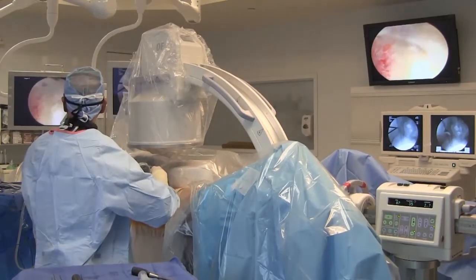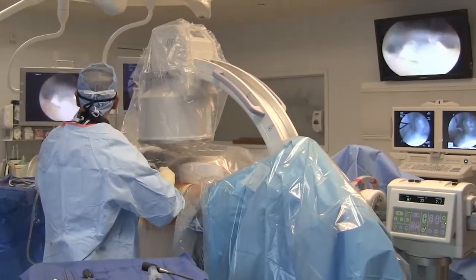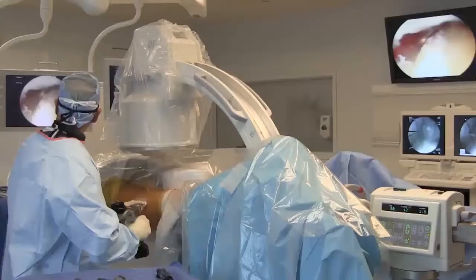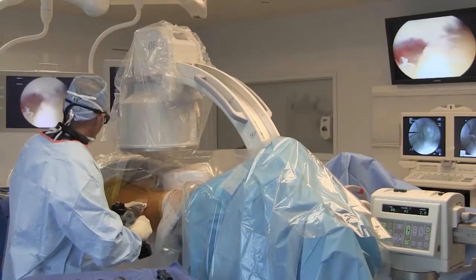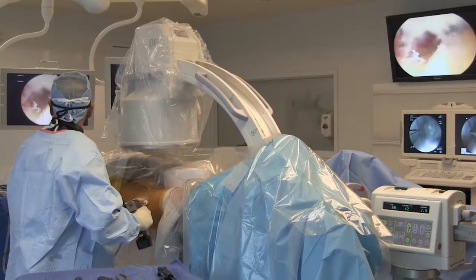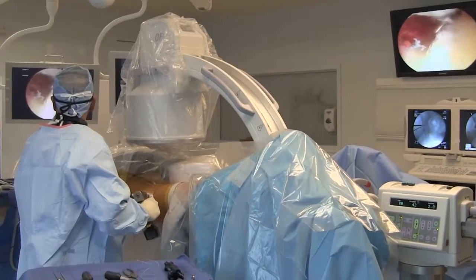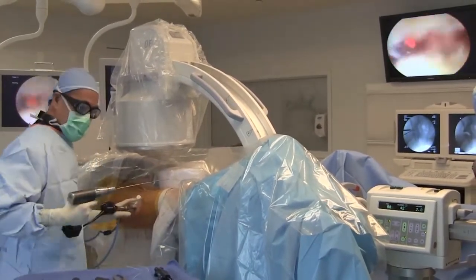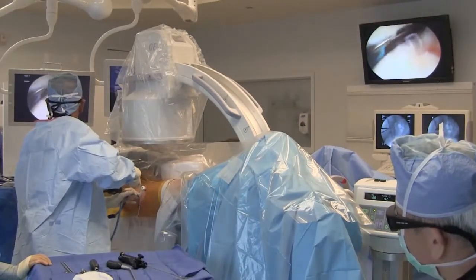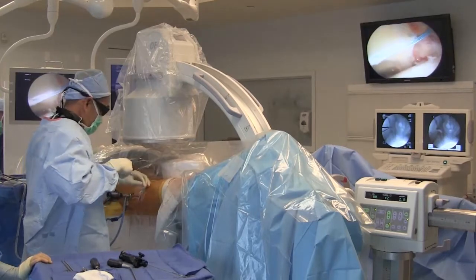To minimize traction time, arthroscopic acetabuloplasty using fluoroscopic templating is performed without hip distraction. Arthroscopic drilling of all anchor sites is also performed without hip distraction. Note that the drill is kept parallel to the floor to avoid anterior rim iatrogenic joint penetration. Hip traction is not reapplied until time to pass sutures through or around the labrum.